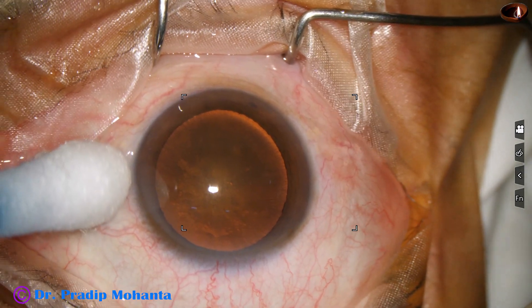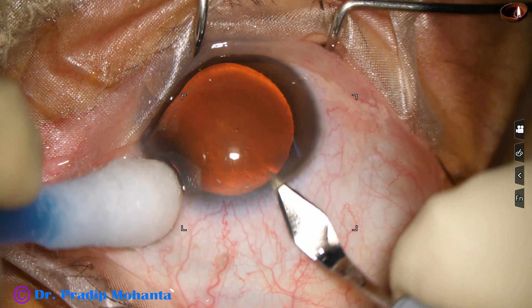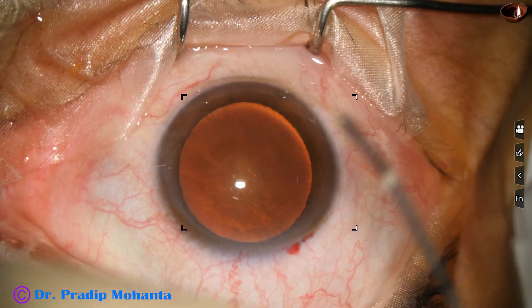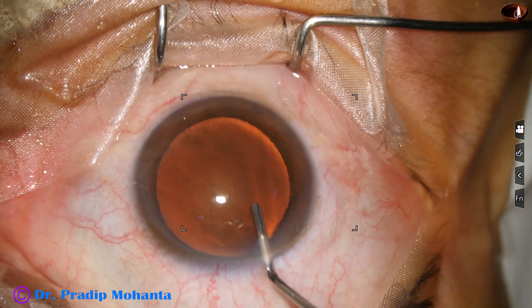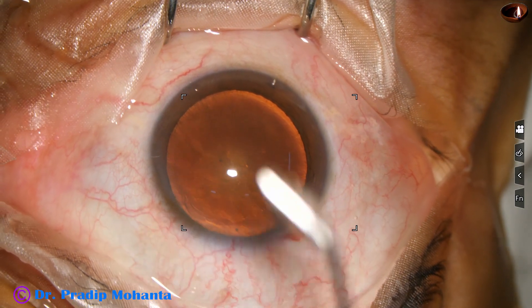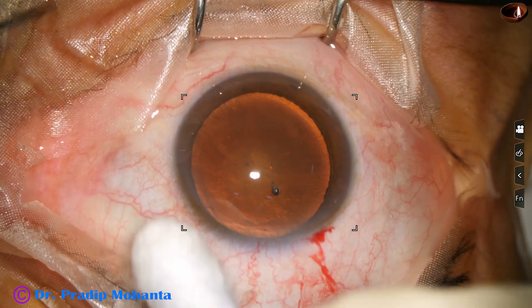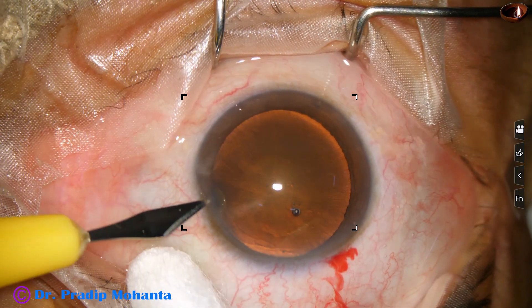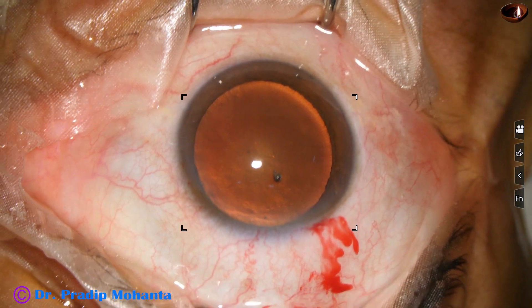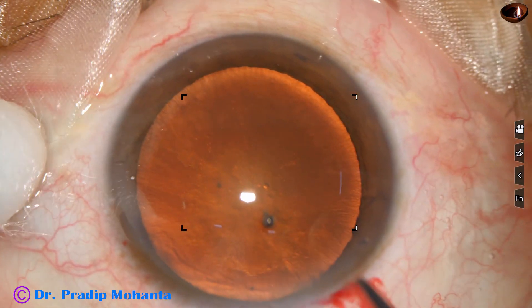The main incision is placed with the help of a 2.8 mm steel keratome at the posterior aspect of the limbus. The anterior chamber is then filled up with 2% HPMC. A side port is made on the side of the main incision about 3 o'clock hours away. When we place the side port about 3 o'clock hours away, the astigmatism induced by the main incision is neutralized to some extent by the side port.